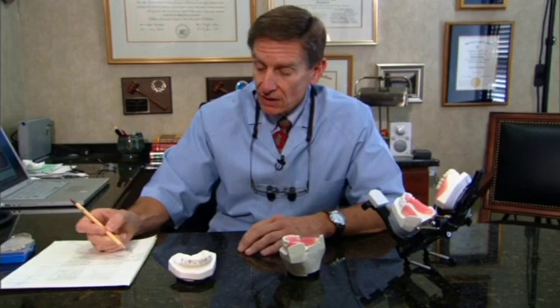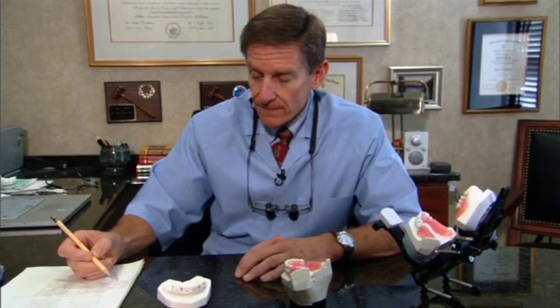Let me tell you where we are right now. Our preliminary mouth preparations have included the removal of, and I'm going to refer to my notes, teeth numbers 1, 2, 3, 13, 14, 15, and 16. So all of the upper posterior teeth, 18 and 31. If you look at the panoramic x-ray and the full mouth series of films, you will notice that there's dramatic loss of hard and soft tissue, both horizontally and vertically, on all of these teeth.